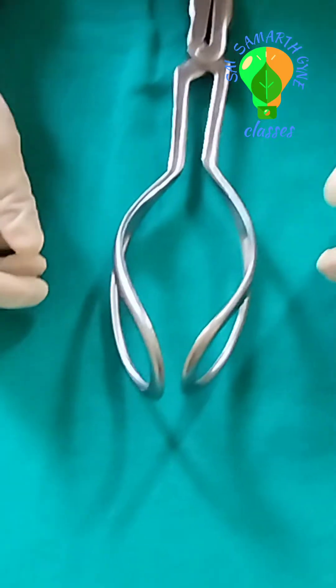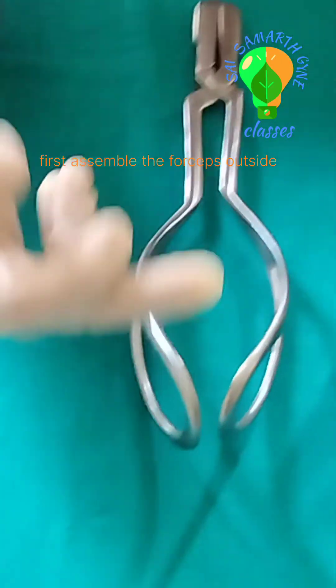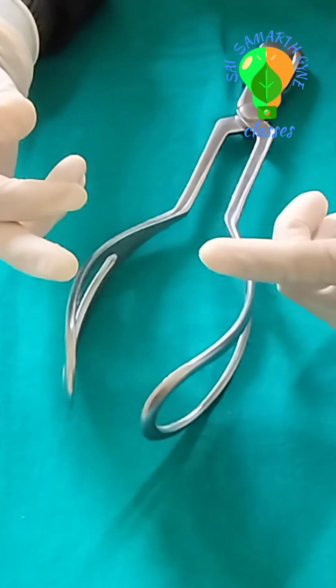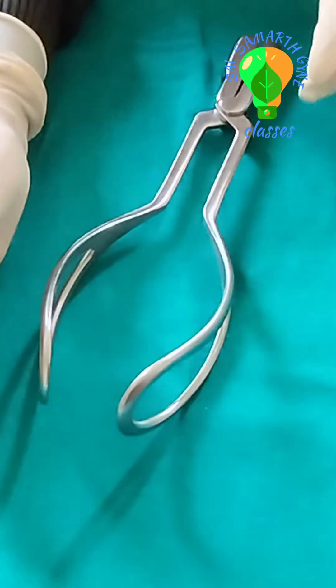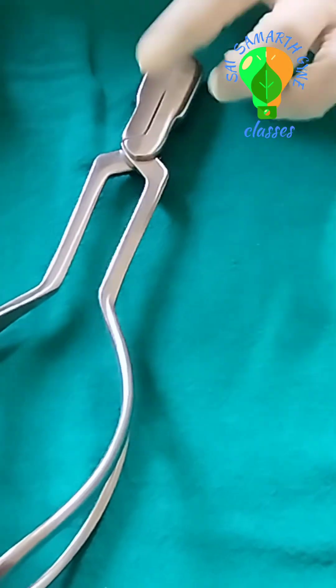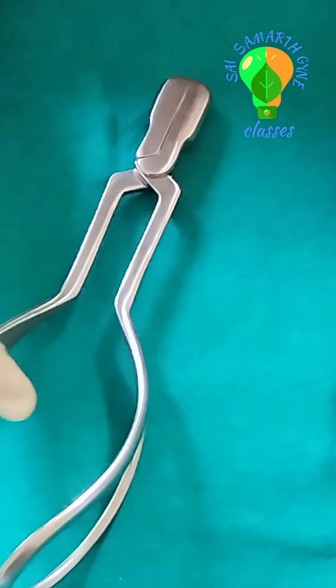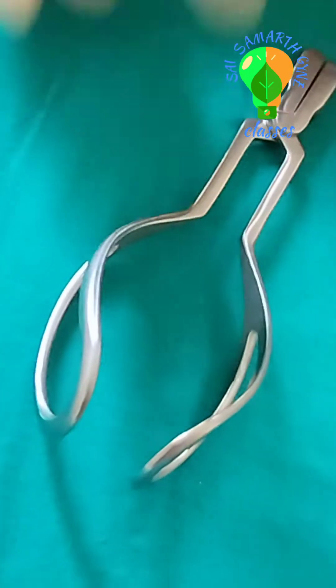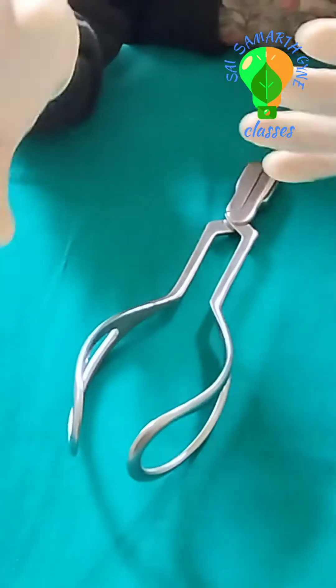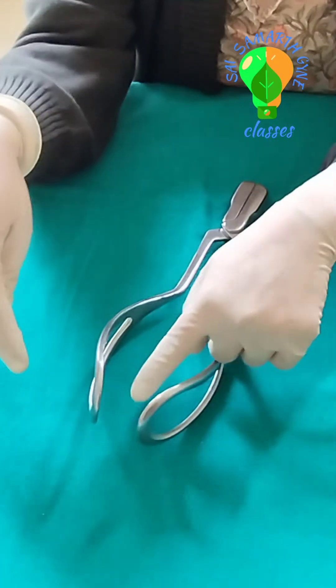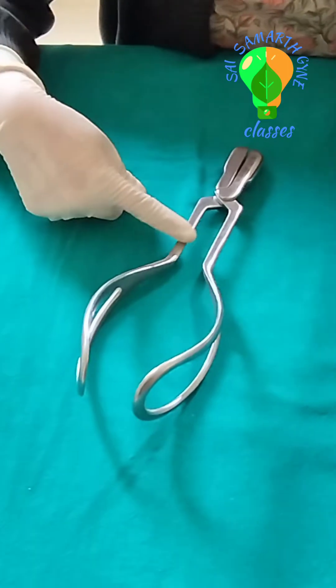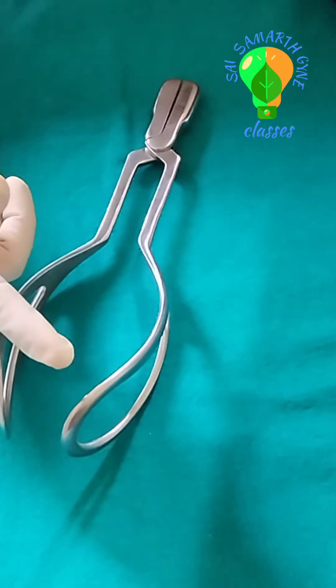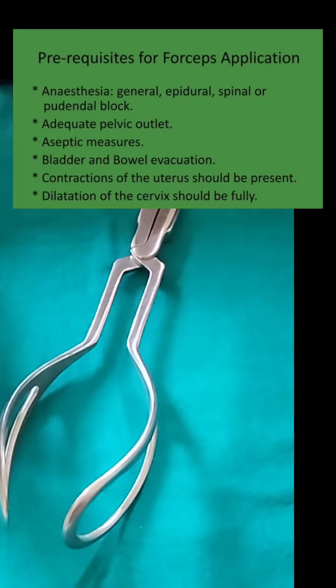When the forceps is assembled, two things we can see. One is the curvature on the assembled forceps. It accommodates the fetal head. This is the cephalic curve. Here the upward curve which is visible over here, the upward curve is known as the pelvic curve and it fits inside the maternal pelvis.